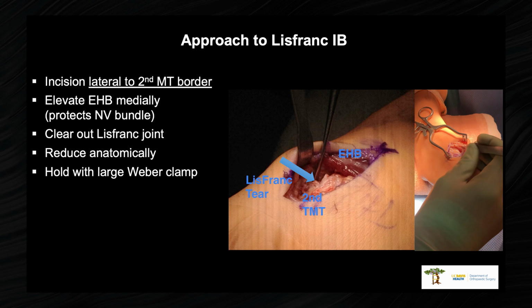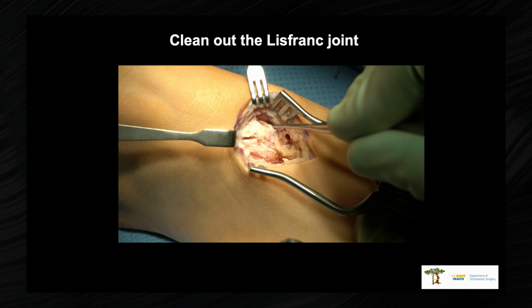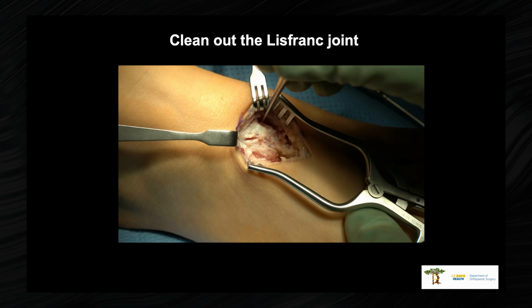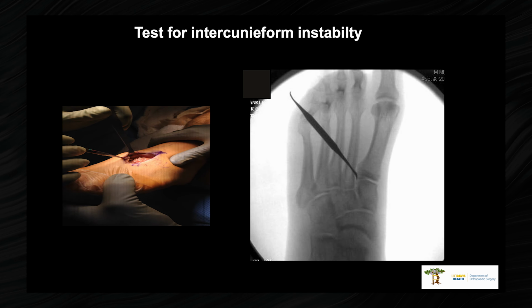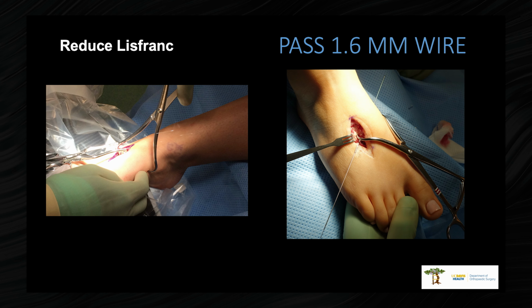I like to make an incision on the lateral border of the second, between the second and third TMTs, and this allows you to really clear out the LisFranc. I don't favor the old-fashioned AO incision straight over the top. You can see right in the joint, and then it allows you to do a medial incision if you need to. This allows you to test for intercuneiform instability. You can see right into the joint, and you reduce it.